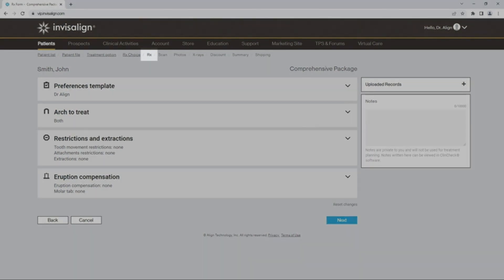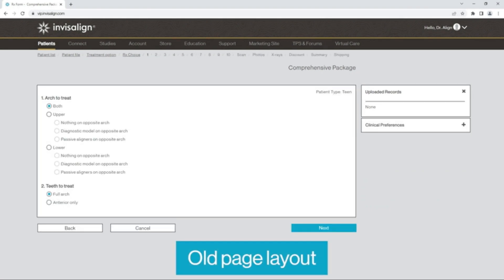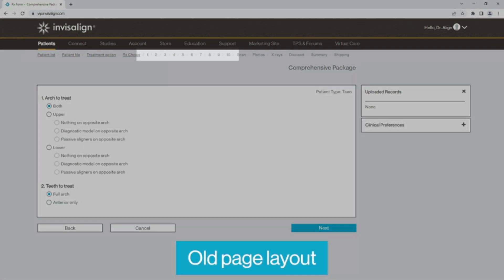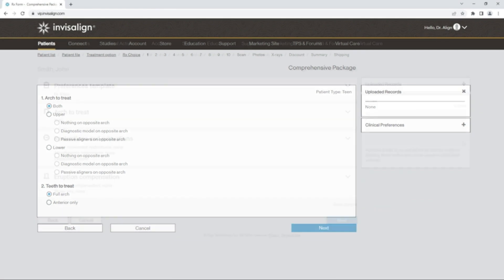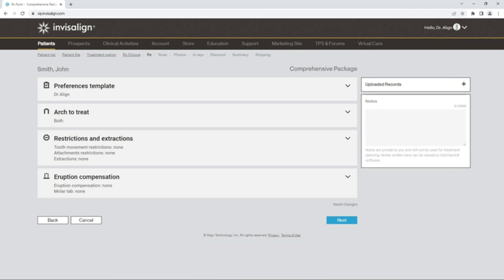The FlexRx form dramatically reduces the steps required for case submission from ten pages to one, gives you more flexibility while treatment planning, and helps you receive consistent, reliable ClinCheck setups when using Preferences template. Let's get started!